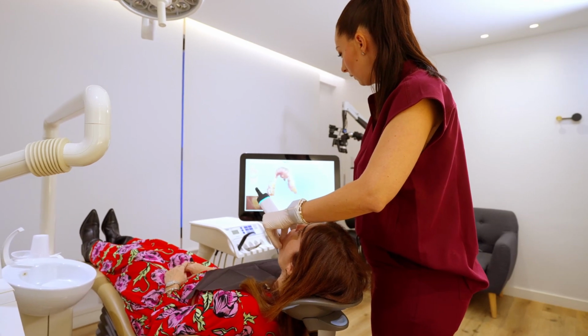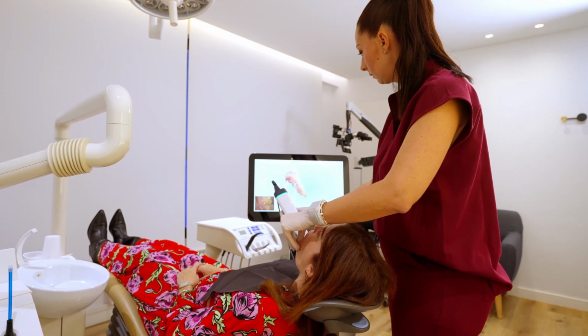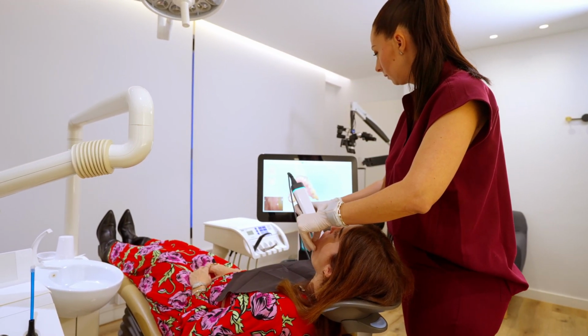As you all know, humans are visual by nature. To understand and believe, they need to see. Our iTero intraoral scanners, and notably now the new Lumina scanner, are excellent tools to facilitate visual communication with our patients. Let me take you now through a typical consultation with our patients on a daily routine basis.